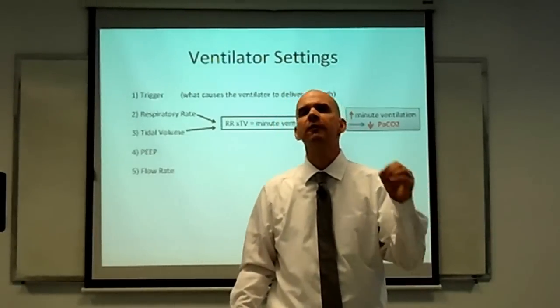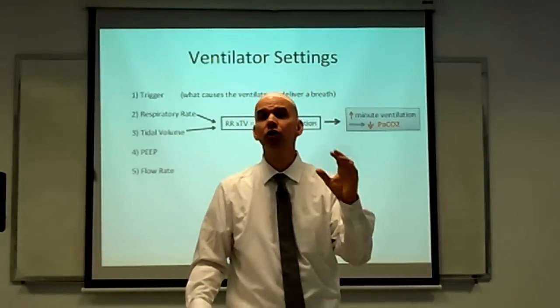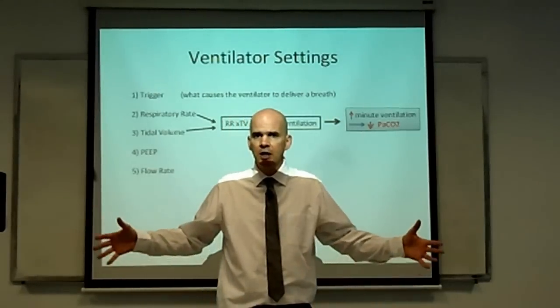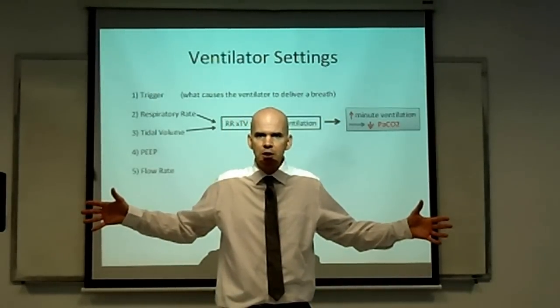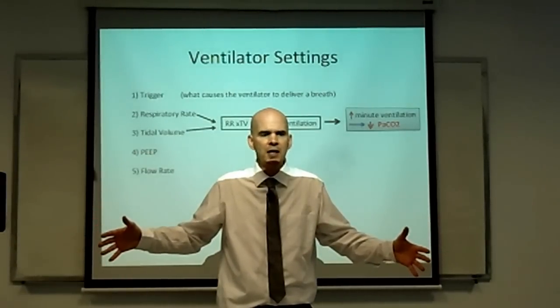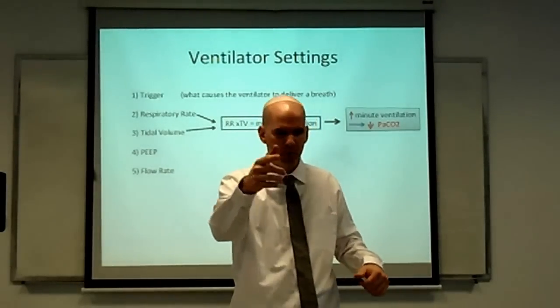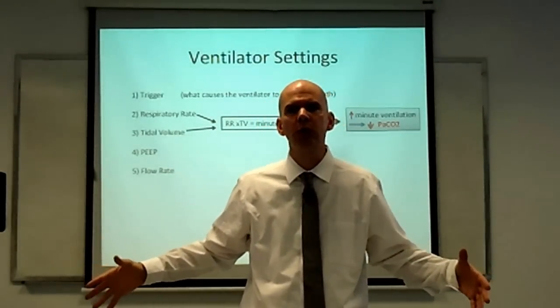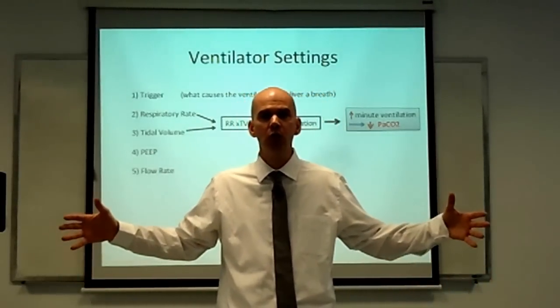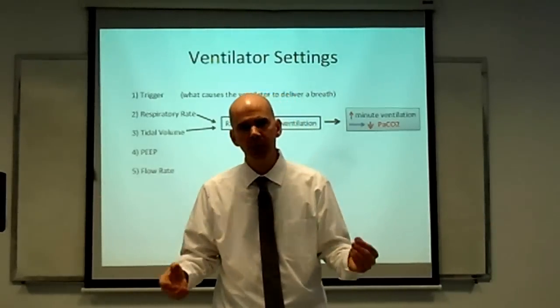And that's a real problem if the patient has COPD. COPD patients take a long time to exhale. So if it took a long time to inhale, then during their exhalation, they might be taking so long that they run out of time and a new breath gets delivered before they exhaled all their old air. In this case, you get a breath stacking on top of the old one, and you end up with excessive stretch, and you end up with barotrauma.